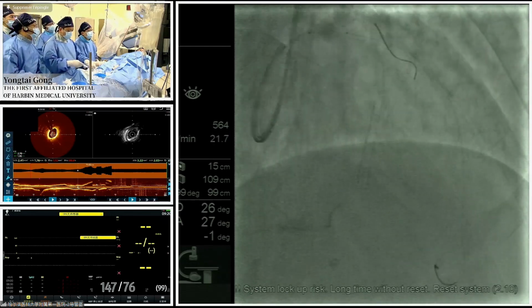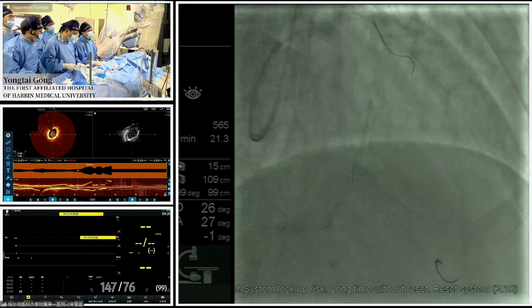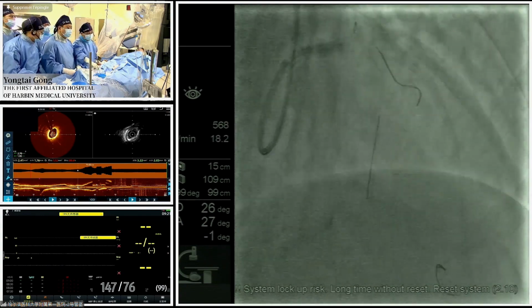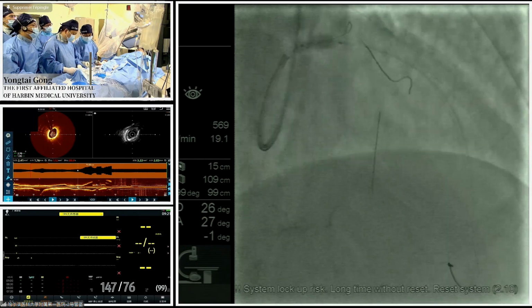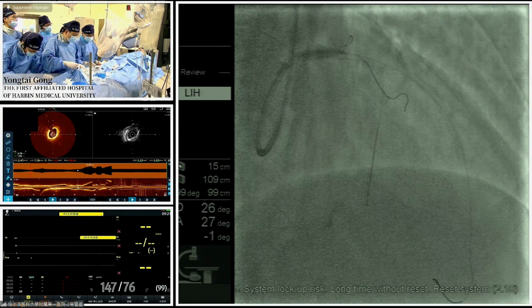Vessel trauma to soft tissue is minimized as the sonic pressure wave passes through non-calcified tissue as a result of minimal differences in density. Compared with RA, the IVL is very safe, and the risk of no flow is very, very low. Of course, inherent to its concept, calcium fragments remain in place after IVL treatment, potentially reducing the occurrence of slow flow or no reflow.